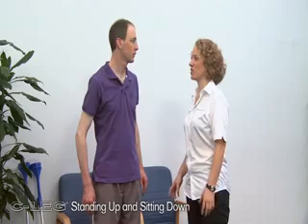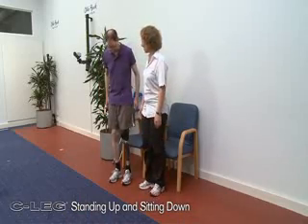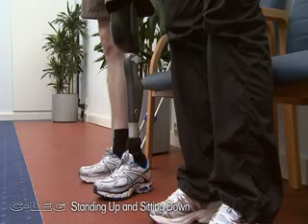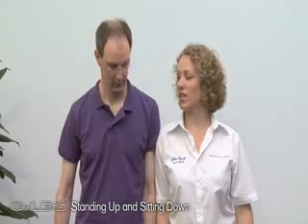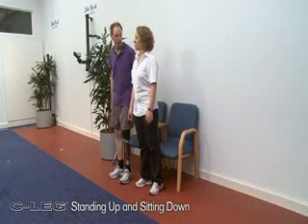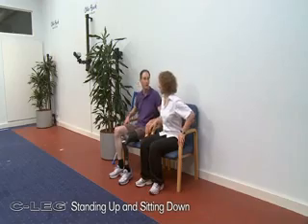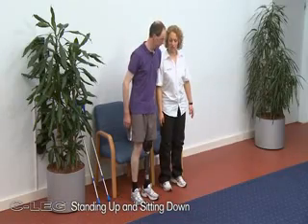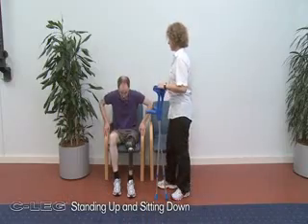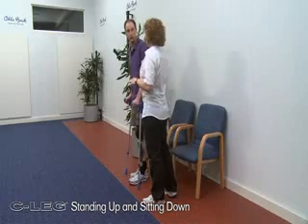In many cases, the patient's perception regarding the sitting speed is highly subjective and difficult to assess from the outside. In order for the therapist to get a feel for how quickly the patient is sitting down, that means whether the damping level is properly adjusted, the therapist and patient can sit down at the same time. Here, the chair used by the therapist should be positioned at the patient's prosthesis side in order to offer support for the patient and so that the therapist can pull the patient towards the prosthesis side if required.